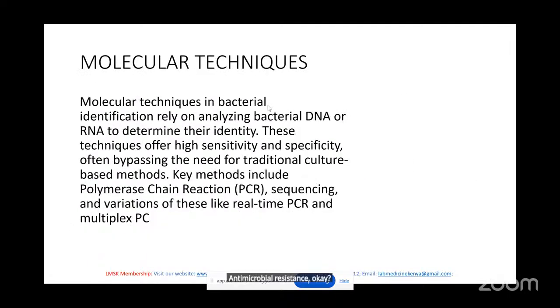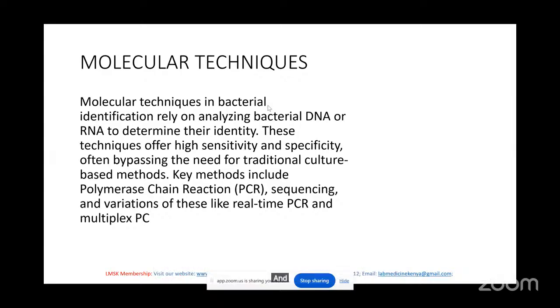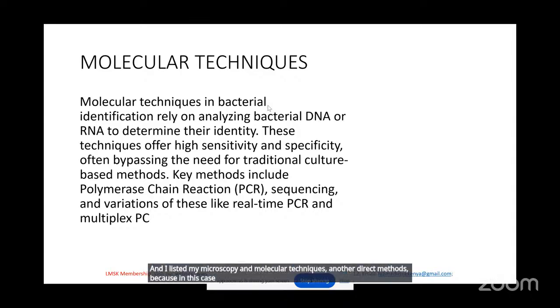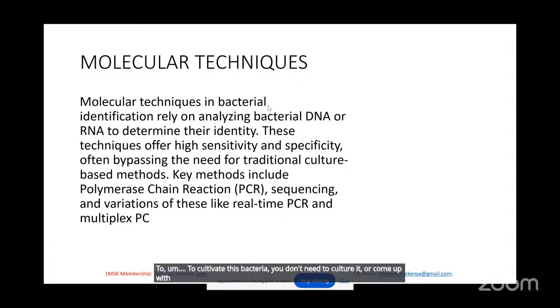Then we have molecular techniques. Like I said, these are direct methods. I listed microscopy and molecular techniques under the direct methods, because in this case you do not need to cultivate this bacteria. You don't need to culture it or come up with an isolate. You just need the sample.